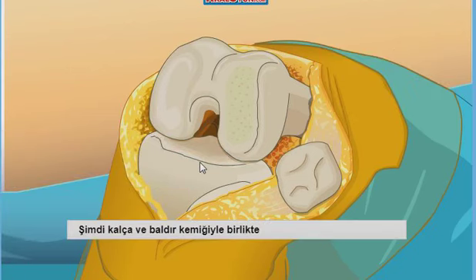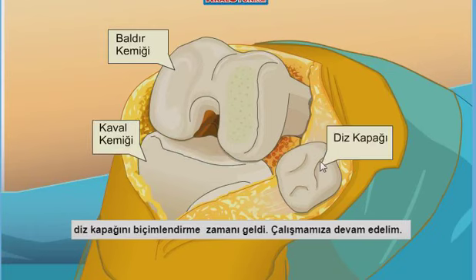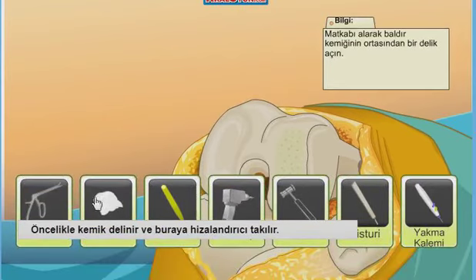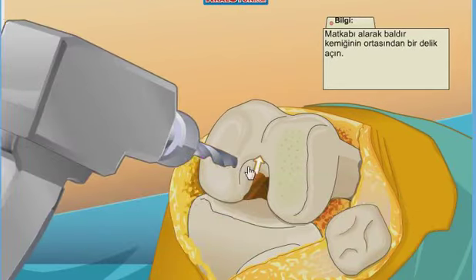Are you a good sculptor? It's time to shape the femur, tibia, and patella, so the new knee components fit properly. A hole must be drilled inside the femur to set up the distal femoral cutting jig and alignment device.